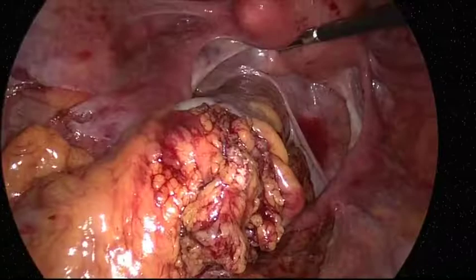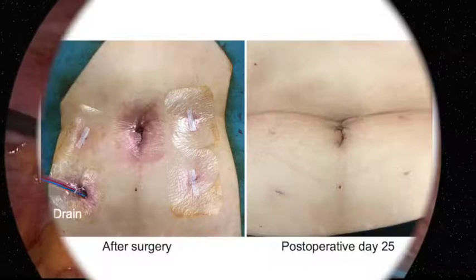A 19 French drain is placed to the pelvis through the right lower 5 mm incision. The wounds are small and barely noticed on the 25th postoperative day.